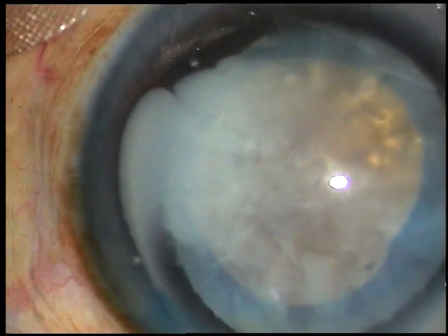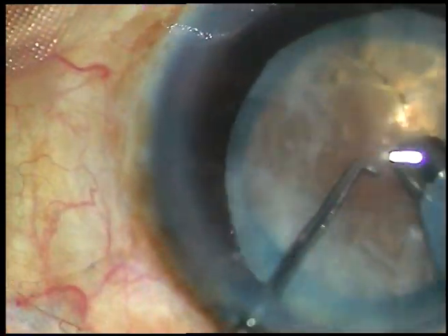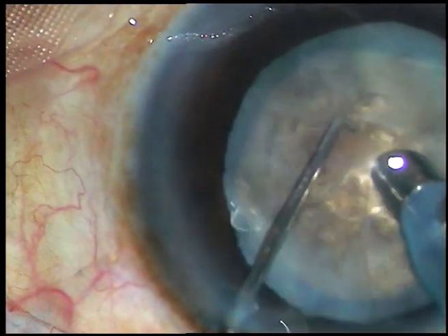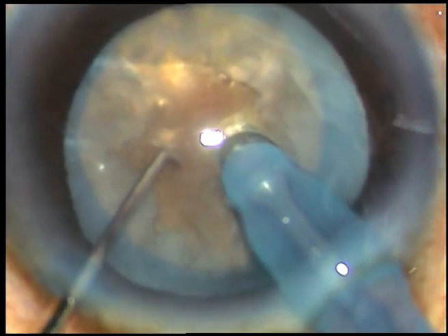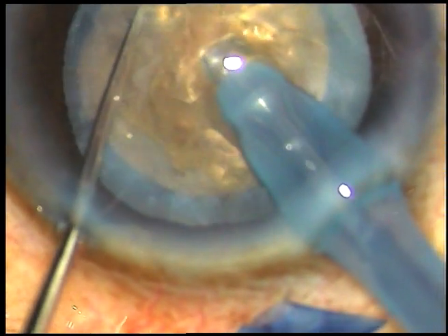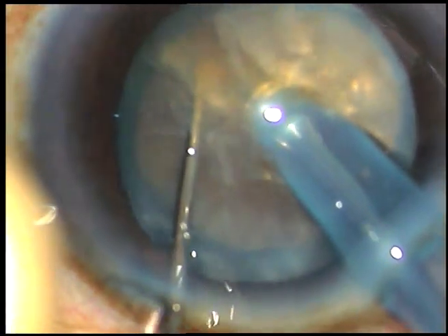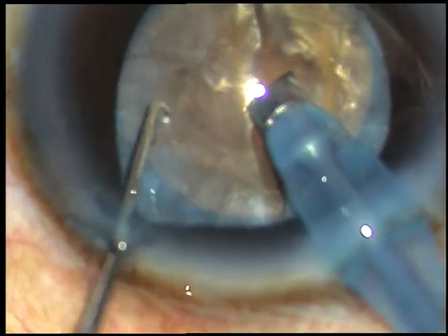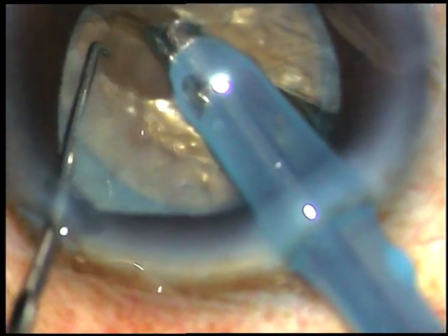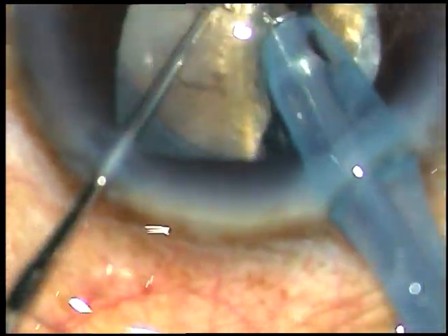Hydrodissection is not required since the cortex has degenerated into a milky fluid. Now I am going to do what I call a submarine chop — go into the substance of the nucleus, move through it like a submarine, cross the central part, go towards the opposite equator, and then chop. Go to a deeper plane with the chopper and divide the nucleus into two parts. I have rotated it 180 degrees and I have been able to separate this hard nucleus into two halves.